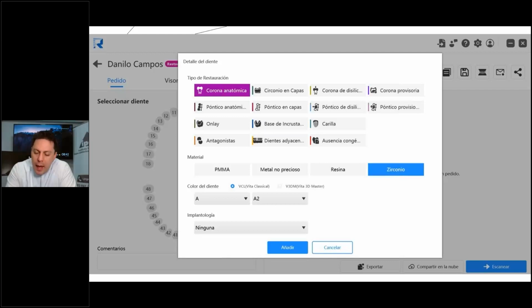That was what I'm saying, that if we are going to take the color of our tooth, remember, we need to take the color of our tooth wet, humid. Why? Because that is actually more reliable to take the color of our tooth or the adjacent teeth of the tooth that we want to restore, because it's different when we do a tooth wet than a tooth dry.